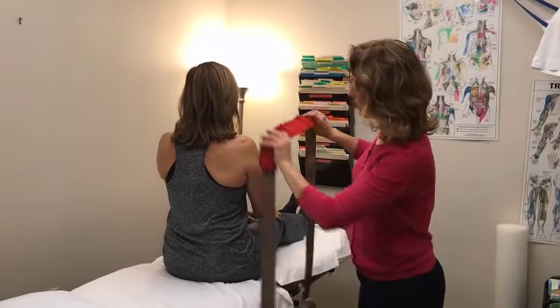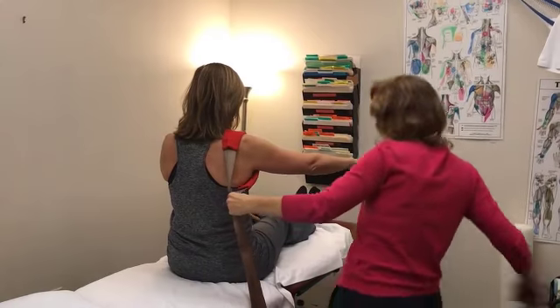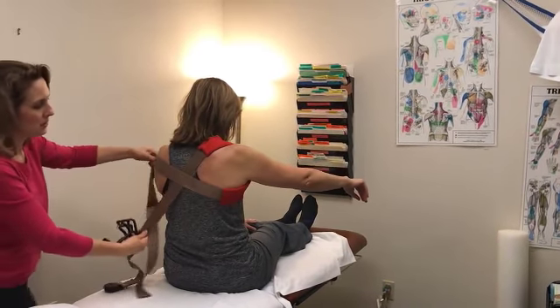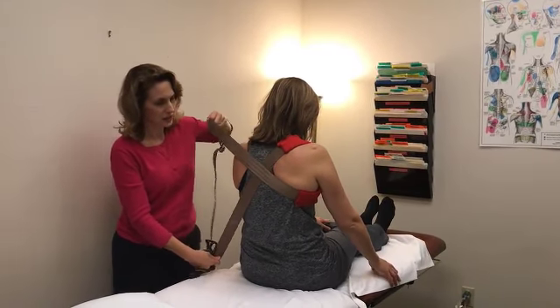So what we're going to start with is we're going to place the belt around the patient's shoulder. And I'm going to pull this around. So I'm basically making an X, kind of a figure 8 on their back, and I hold that as I have the patient lay down.